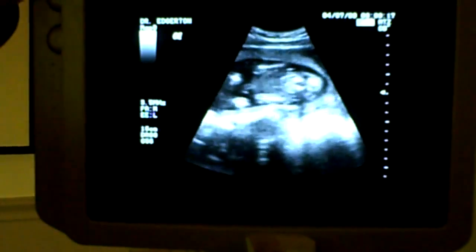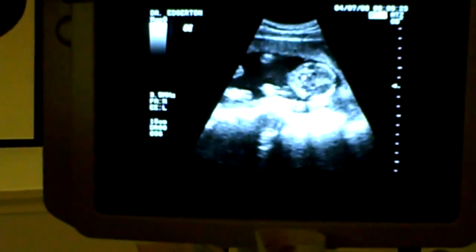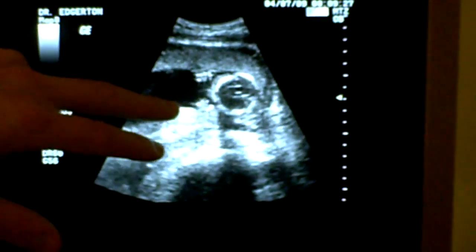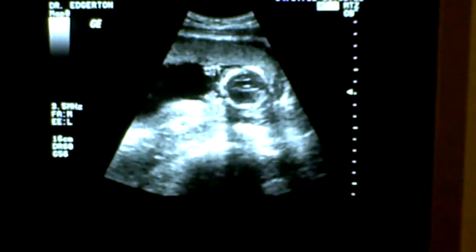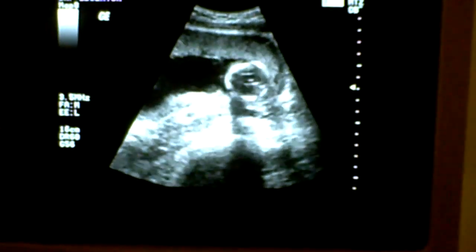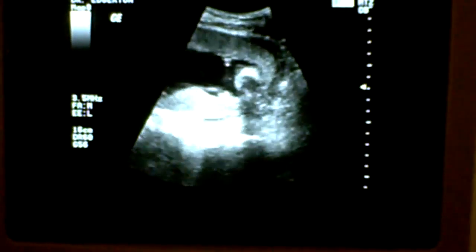That looks cool — you see the shoulders and arms there. There are the hands, you can see the fingers and the digits. Baby's got his hands up kind of near its face — so that's neat.